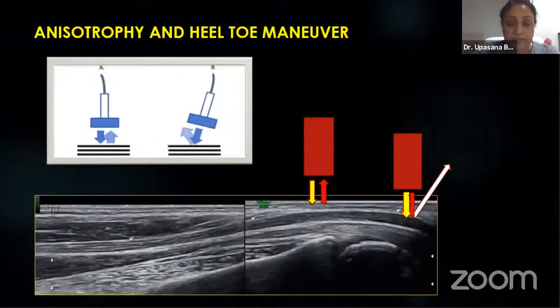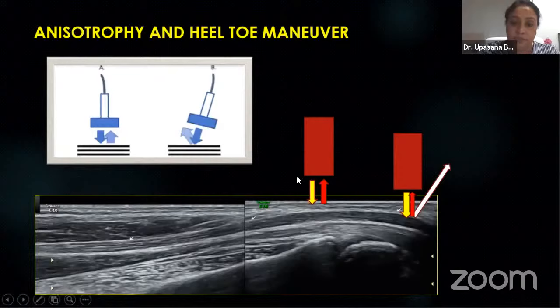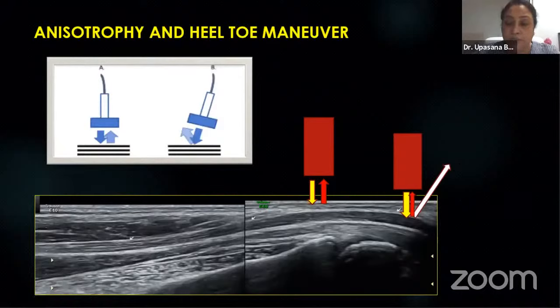But at the beginning of our scanning, we should know a little bit about anisotropy, because it has a very notorious effect in MSK ultrasound. The thing is simple. When we keep our probe parallel to the structure we are imaging, all the sound waves that we send to the structure get reflected back and hit the transducer, there is no loss of data, and we have a very clear, nice image of the underlying structure. But whenever there is an oblique orientation between the probe and the structure, because the structures move obliquely, with repeated movements up, down, and side to side, there is every possibility of an oblique orientation with the probe. Some of the sound waves will be angulated back and go away from the probe, and we will lose data. This lost data will be represented as a hypoechoic area of the structure on our ultrasound monitor that can confuse us for some pathology.